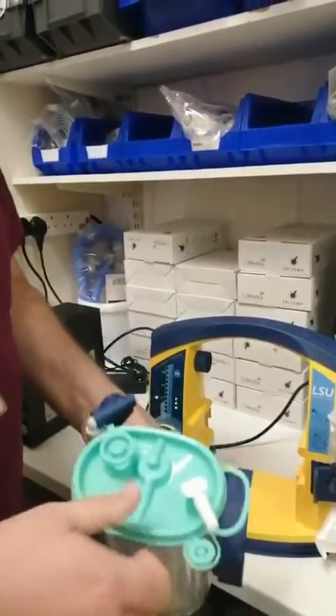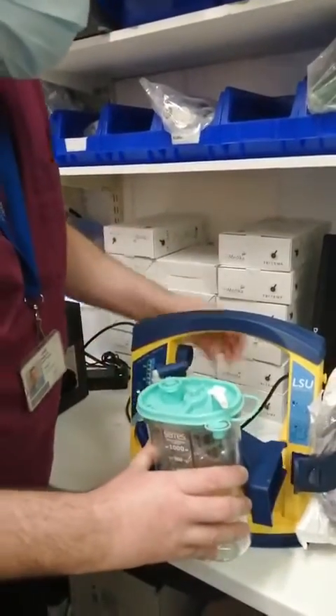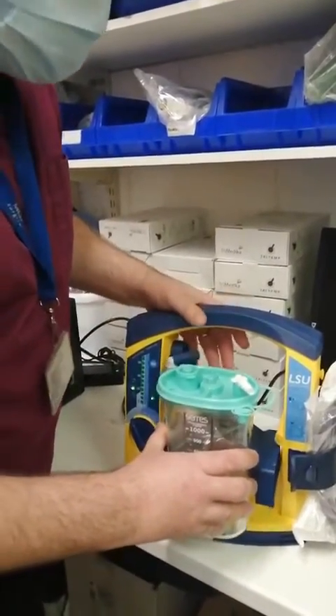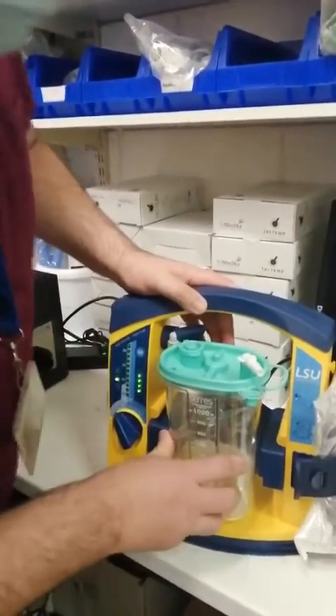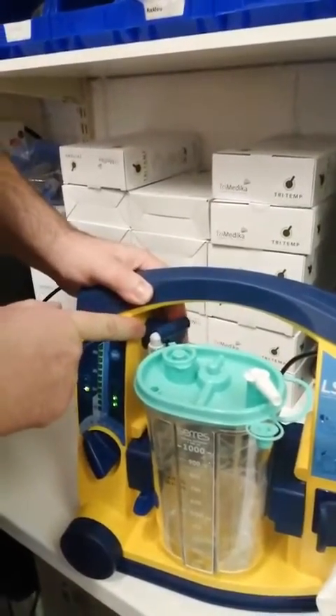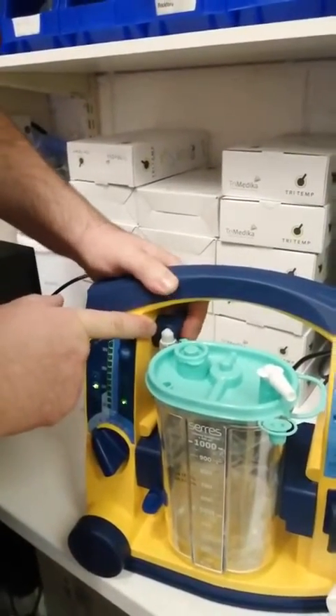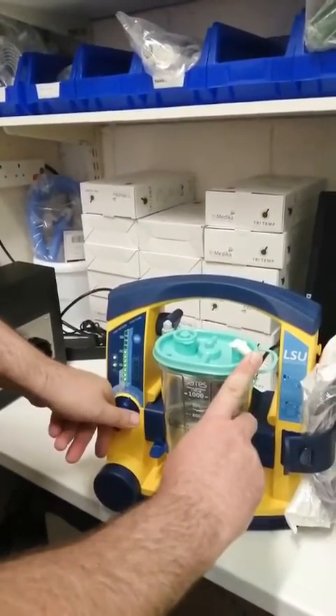The liner is changed as already previously demonstrated. The canister and the machine are cleaned with a mild detergent and an alcohol wipe. Then the cassette is reinserted with the liner. Once you hear the click — that's important. Ensure that this is reconnected up on top. Again, do a test to ensure that you have suction and that your apparatus is working.